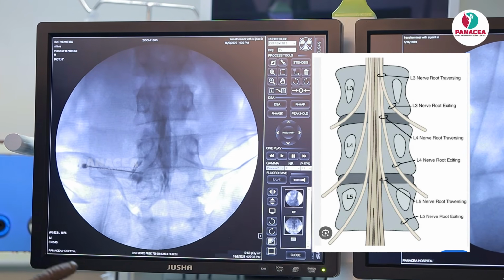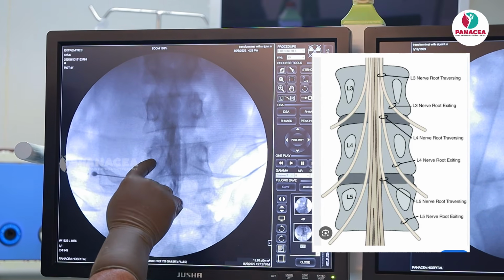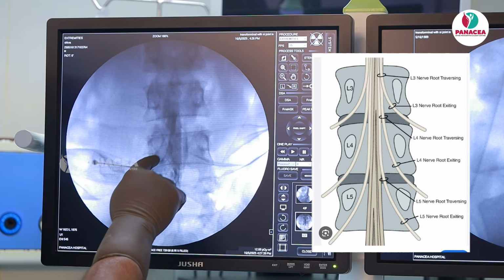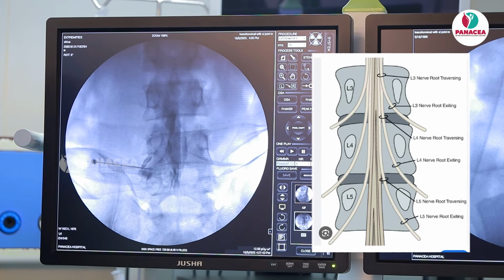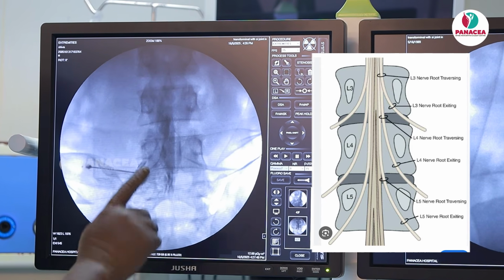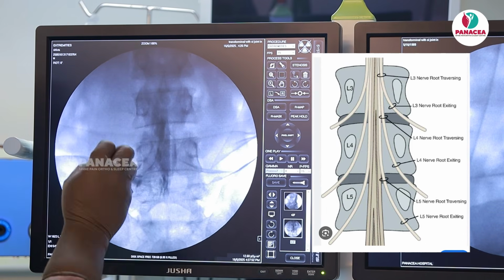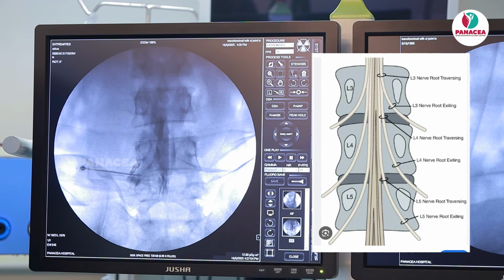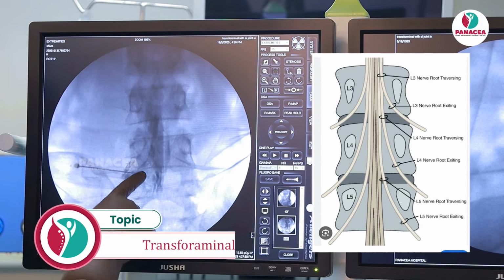If it is subarachnoid, it will never ever come out because the dural sheath will end almost just at the entrance of the foramina, and the dye gets diluted in the CSF. If it is intravascular, the dye has an aberrant spread and it will also disappear, even if you are doing it in real-time fluoro. So, sure shot, it is in the epidural space.